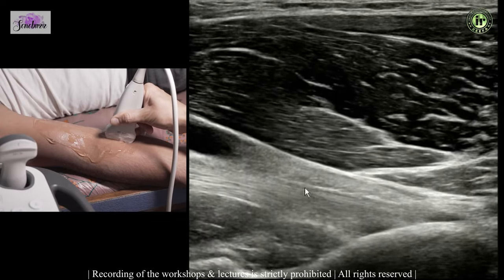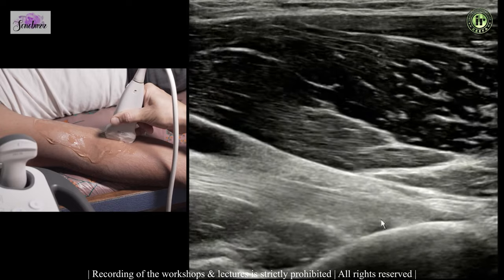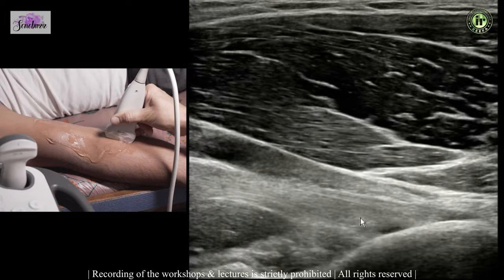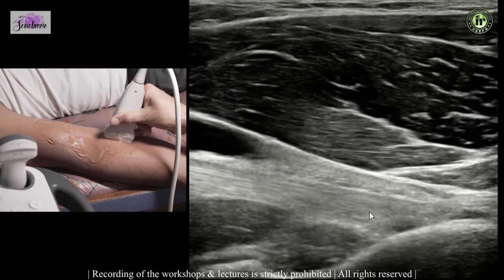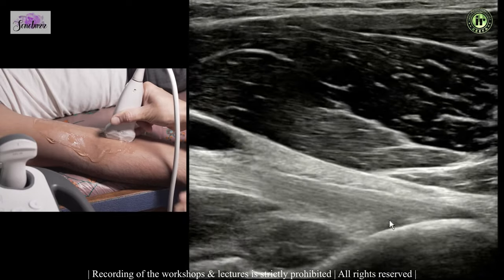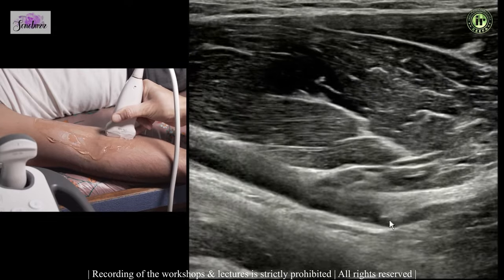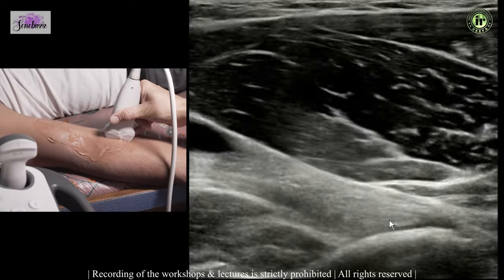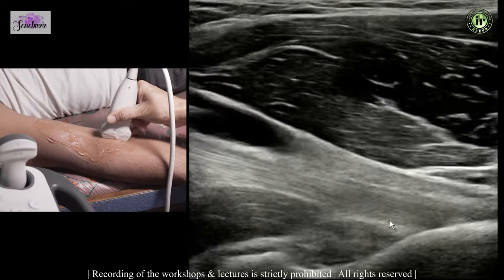There are two components of the distal biceps tendon inserting on the radial tuberosity. The anterior one is the short tendon component inserting distally, and the posterior one is the long tendon of biceps inserting a little more proximally. This is visualized in hypersupination; if you do a little pronation the radial tuberosity goes posteriorly and you cannot see it, but on hypersupination it comes anteriorly again, allowing a dynamic examination.